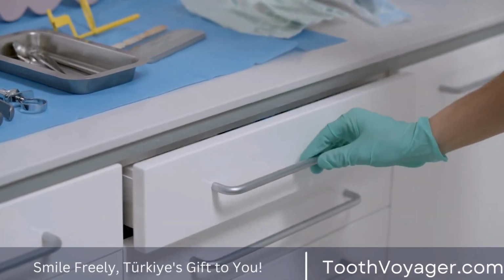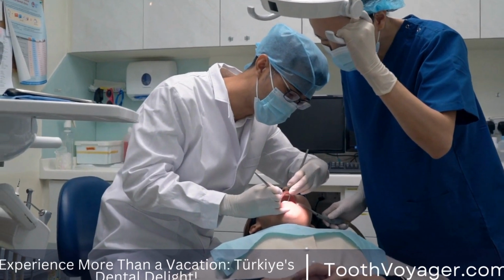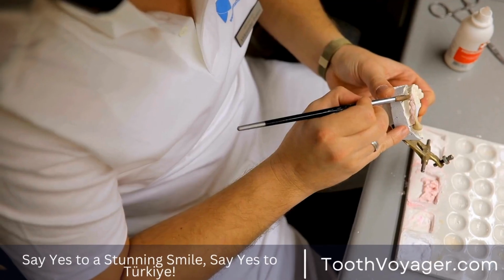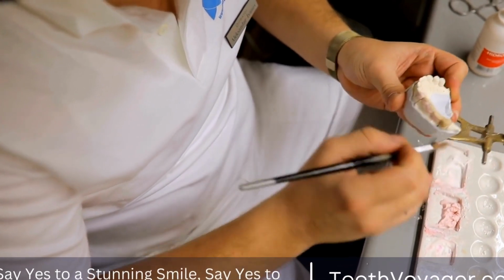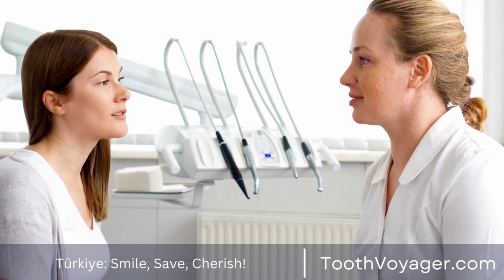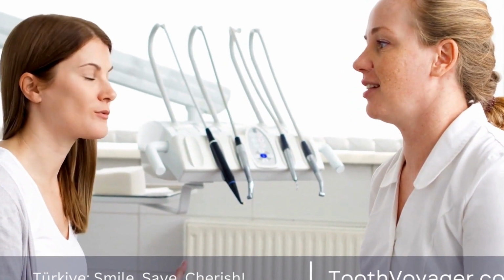Intraoral cameras and digital X-rays. Intraoral cameras and digital X-rays are two more technologies that have transformed the patient experience in dentistry. Intraoral cameras are small, handheld devices that allow dentists to take detailed images of a patient's mouth, providing a close-up view of their teeth and gums. These images can be displayed on a screen for patients to see, helping them better understand their oral health and any issues that may need to be addressed.